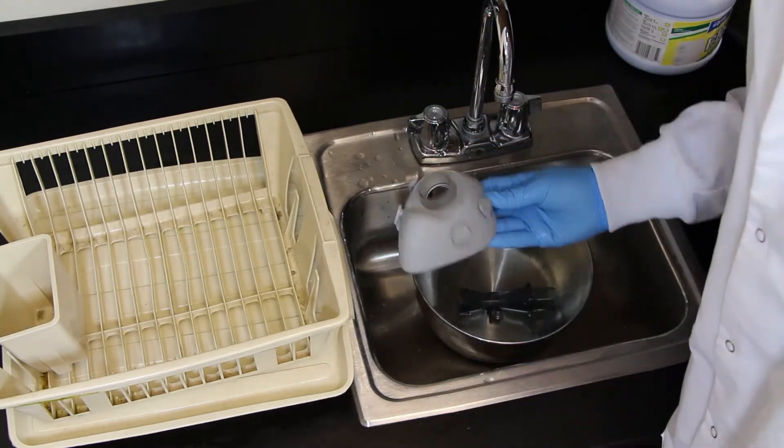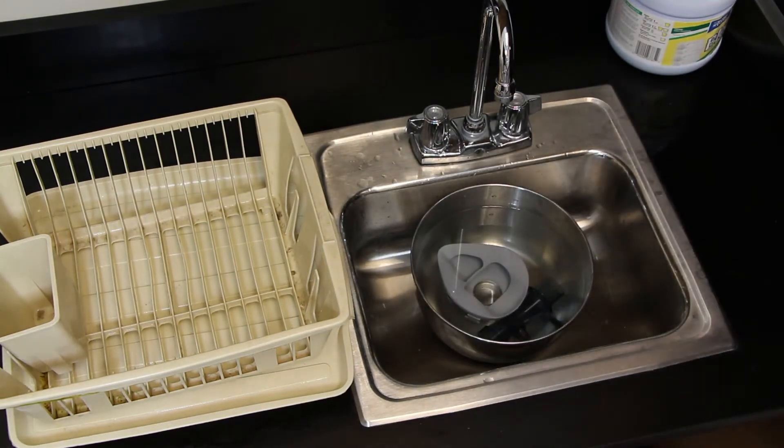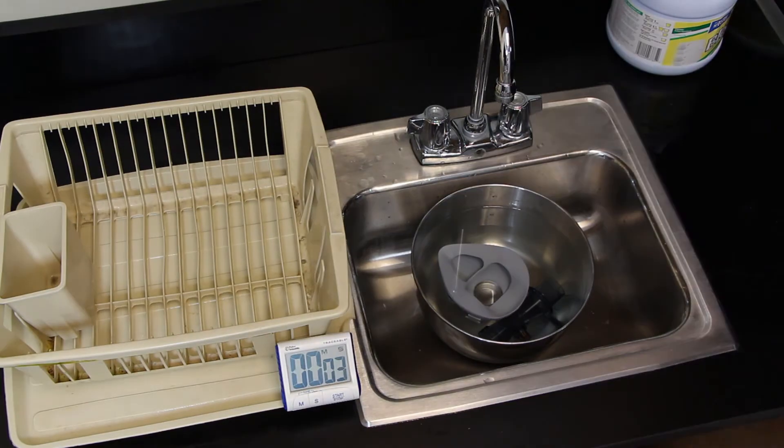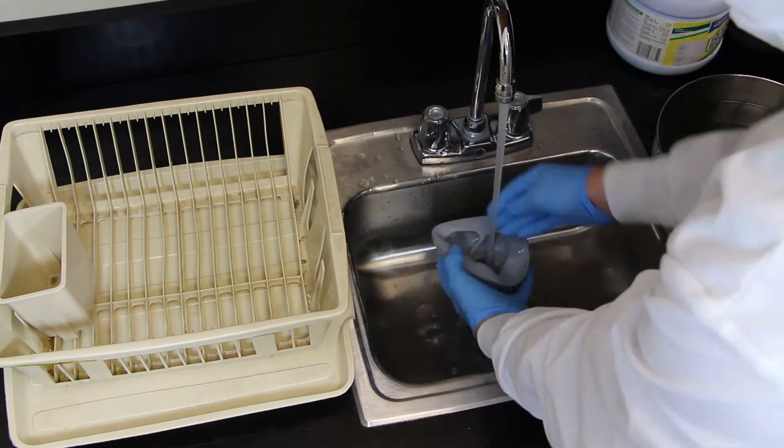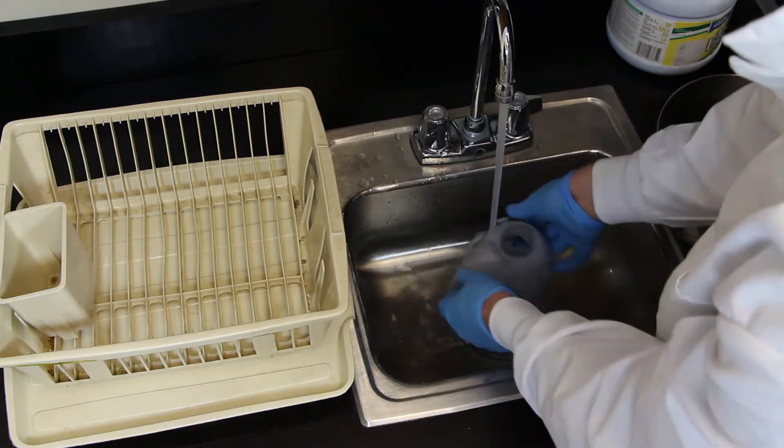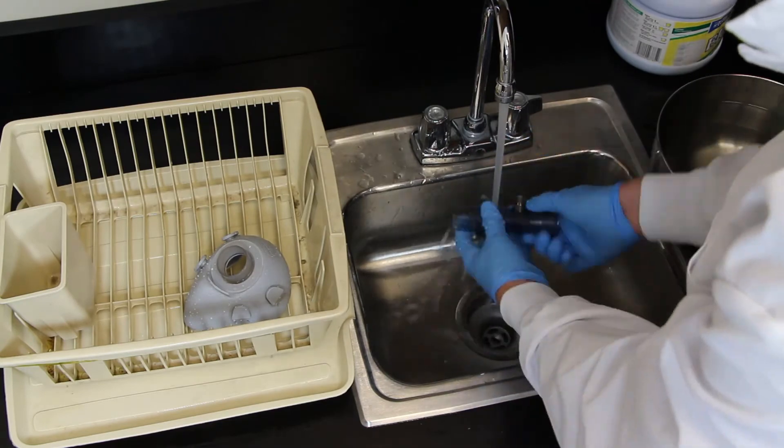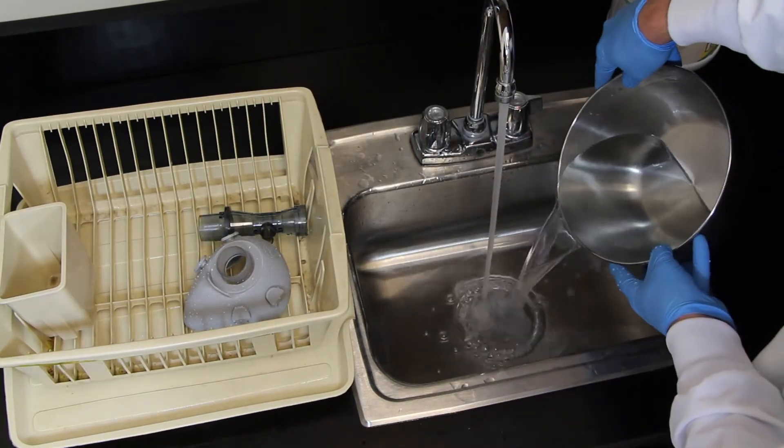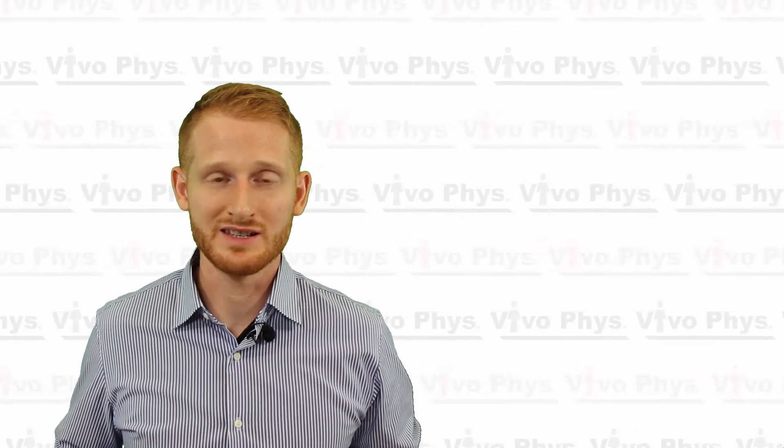When you're doing this, make sure that you don't soak it too long because if you do an excessively long soak in a bleach solution, you can damage the plastic or the rubber of those pieces. Also, again, make sure that you rinse them really well, getting all that bleach residue off.